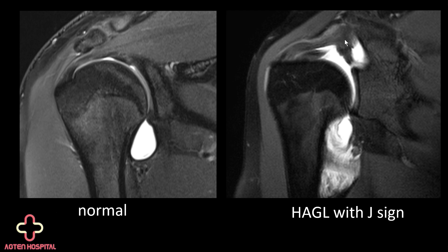We have here an arthrogram and all this bright structure is extravasation or leakage of gadolinium that was injected into the joint, passing through the tear of the HAGL into the periarticular soft tissues. This sign also looks like a J and is frequently called the J sign, which is one of the signs to look for when assessing a shoulder MRI for a HAGL lesion.